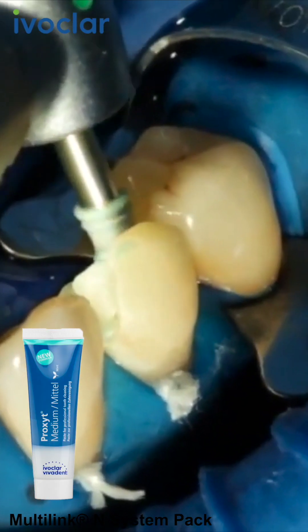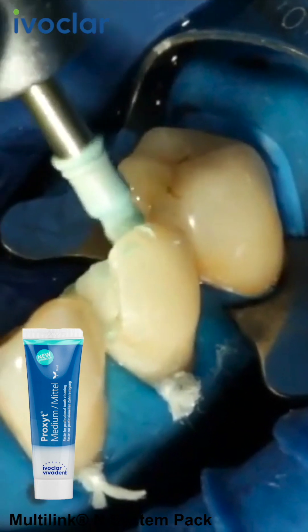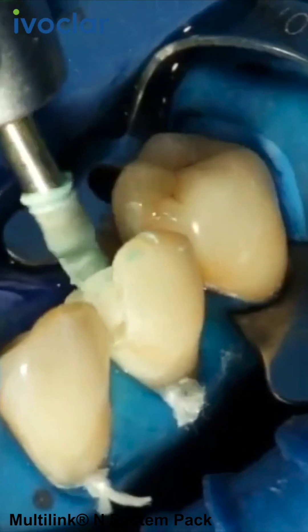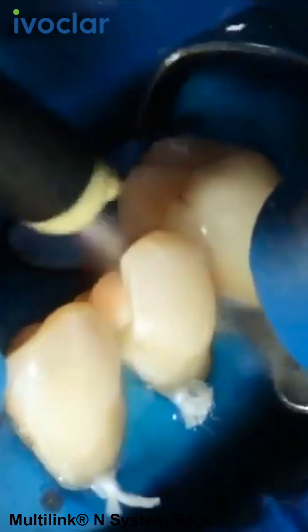Prepare and clean the preparation again with a polishing brush and a fluoride-free cleaning paste, such as Proxite Fluoride Free. Afterwards, rinse the preparation with water spray and dry with air. Avoid over-drying of the preparation.